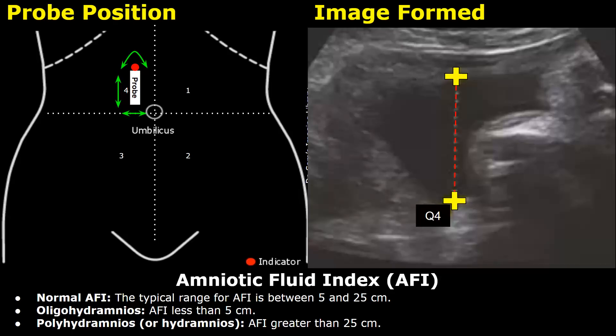You add the four quadrant measurements together and you will get the amniotic fluid index. The normal range of the amniotic fluid index must be between 5 and 25 centimeters.